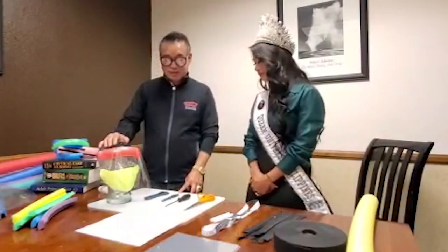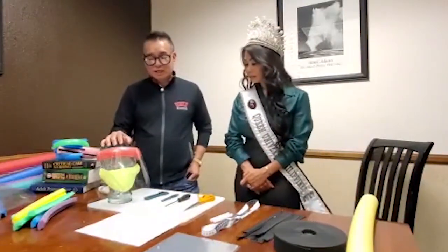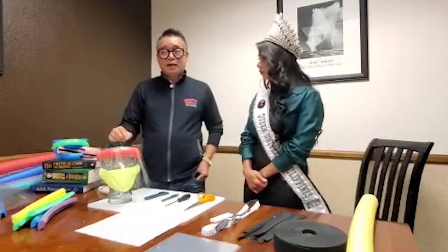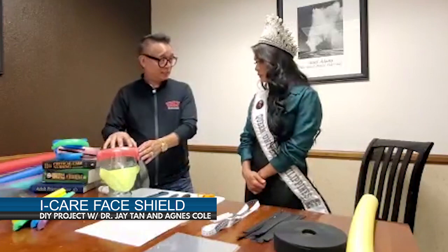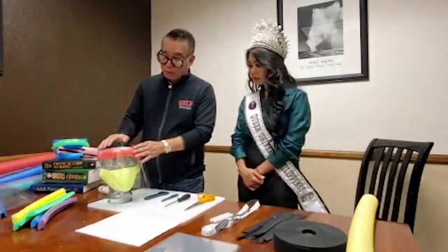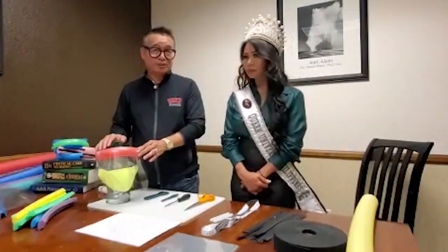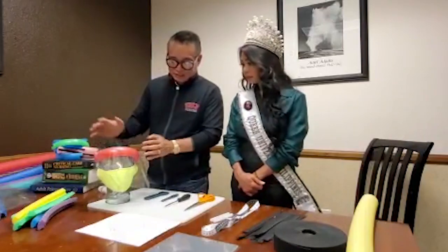So next, we're going to be showing them how to make this iCare face shield. Well, I'll give you a little background. Face shield has been used in the hospital, but only in special procedures. Now with the COVID coming in, it's a very vital piece of PPE for our frontliners because it actually protects them. So my concept was to design a face shield that can sustain, even the staffers will use it in the hospital. So I went around and looked for materials that can sustain even if there are closures due to our protection directives for the COVID.